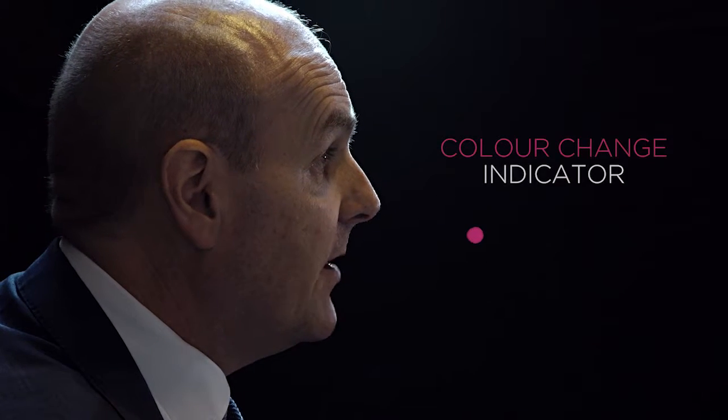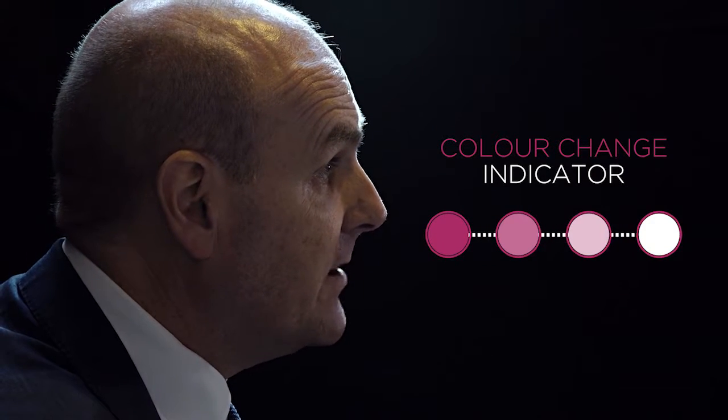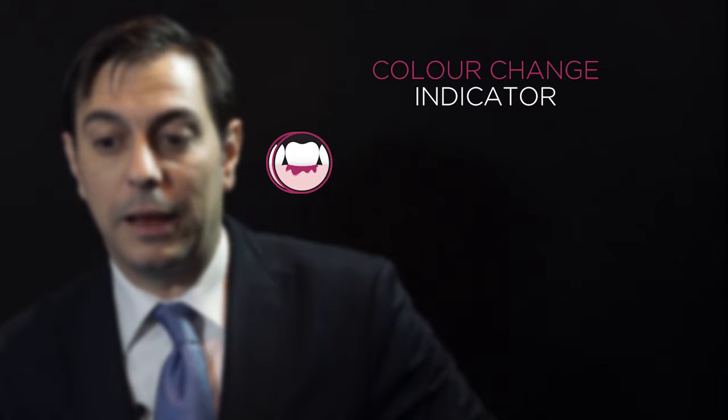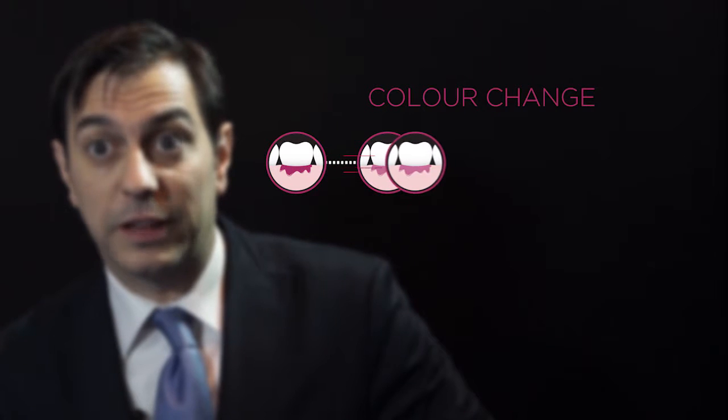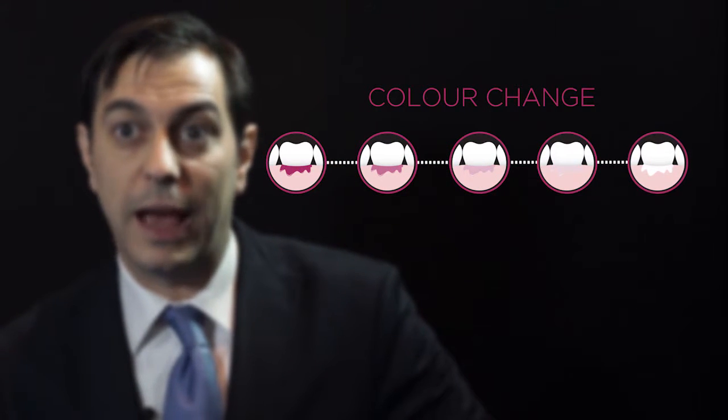One of the main differences with Maxim Elite Chroma is that it's got the color change technology, so you know when to actually remove the cement. The color indicator in Maxim Elite Chroma makes a difference because it gives you exactly the timing when you should get rid of the excesses of cement.